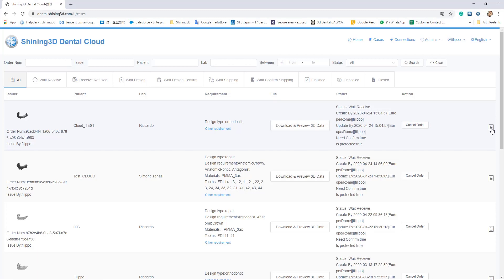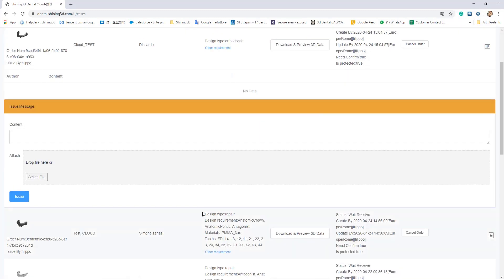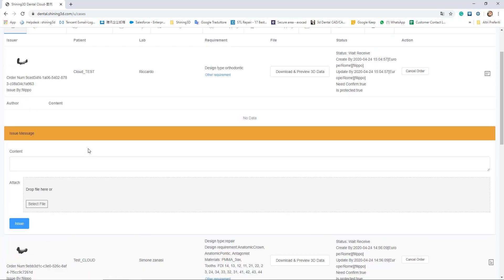In the cases menu, you have a lot of tools useful to communicate with the labs.